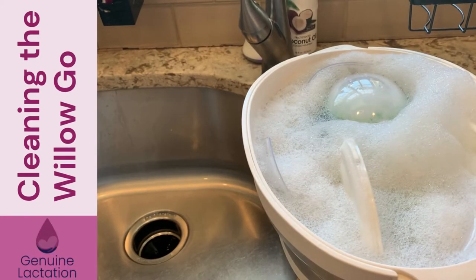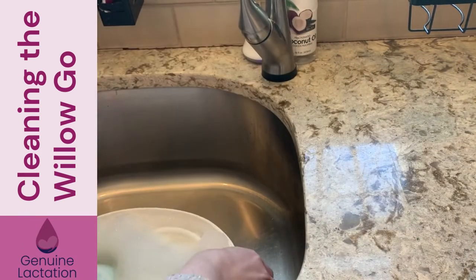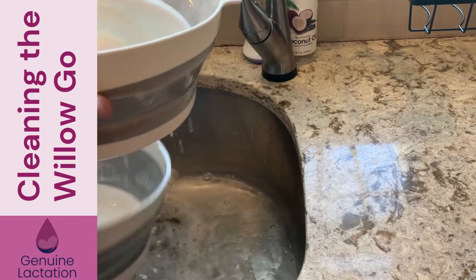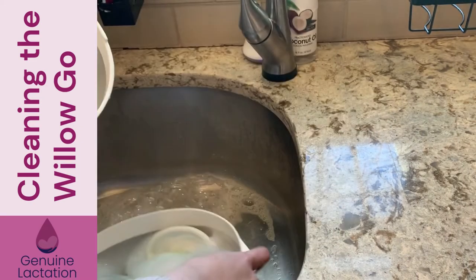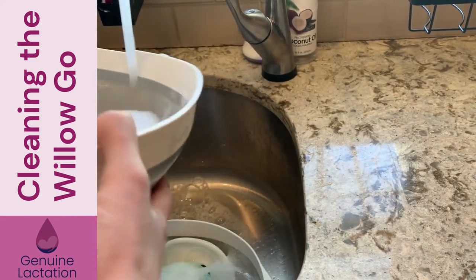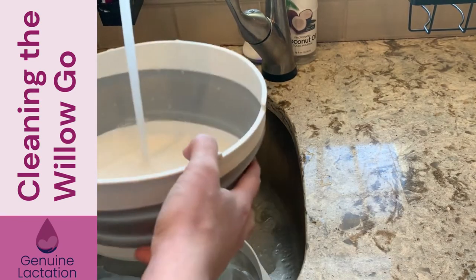This has been soaking for about 15 minutes. Part of the reason I love this wash basin is it's got a little colander inside so I don't have to put my hands in the soapy, milky water — I just pull this out. I'm going to sit this down in the sink and rinse the basin out so I have a clean place to put the clean pump parts on the way to drying or the sterilizer.